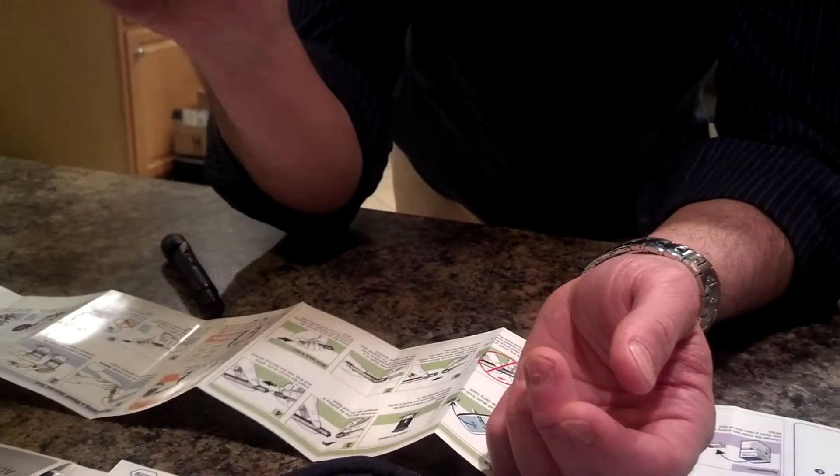What's my blood sugar level? It says 96 — 96 milligrams per deciliter.